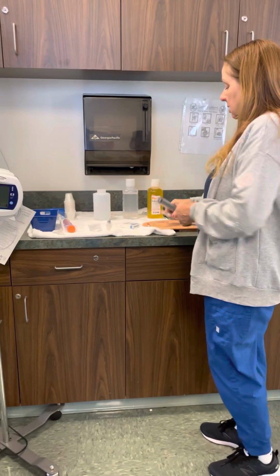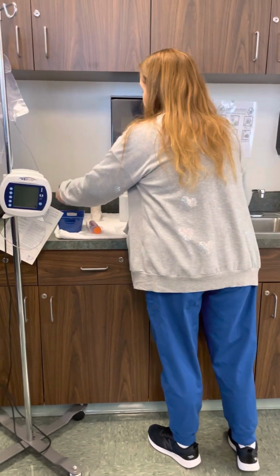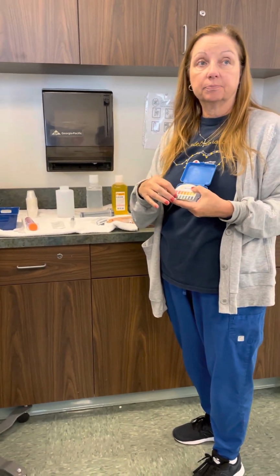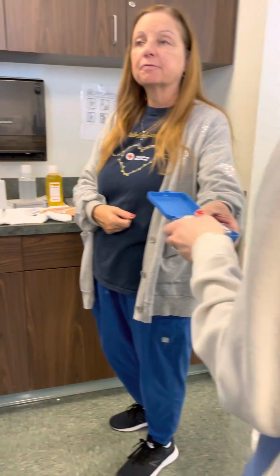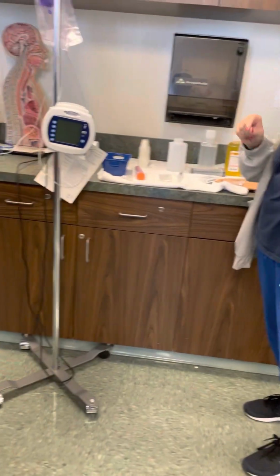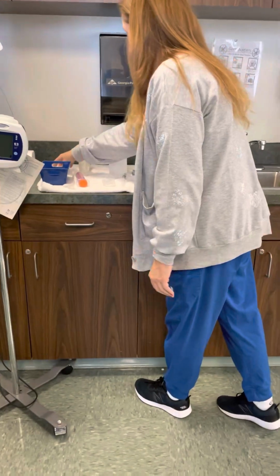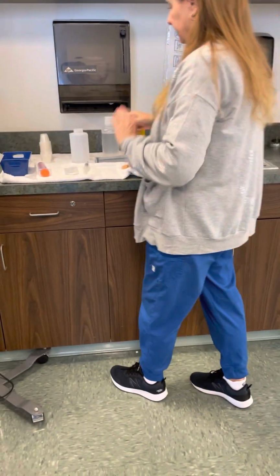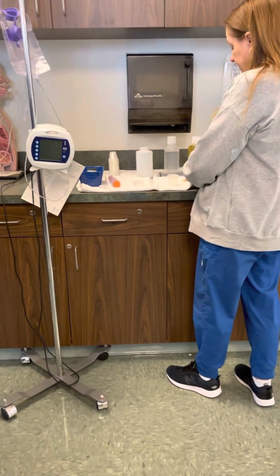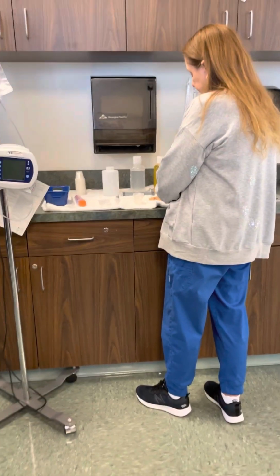So I would go ahead and take the pH paper and squirt it, and then I would compare on the pH scale the color with the number. Okay, so we're going to look for about 5. That tells us that the liquid that I took out through the tube is in the stomach. Okay, so now I've checked my gastric contents, and I put any leftovers back in their stomach. I'm going to close it up.